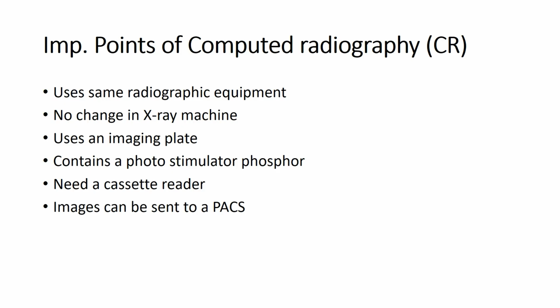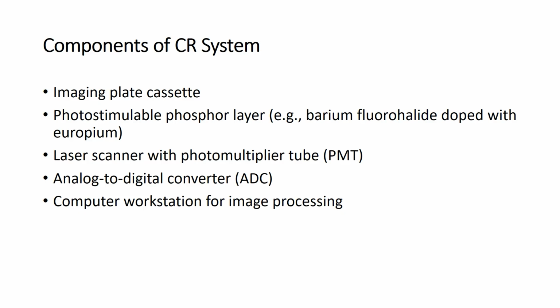That imaging plate contains a photostimulable phosphor plate, which is held by a cassette, so a cassette reader is required. Finally, the image can be processed by a computer and sent to communication software like PACS or DICOM.